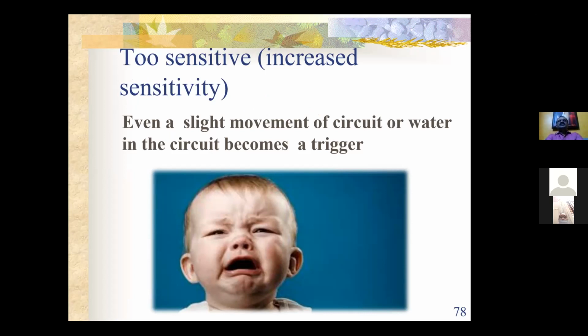So what happens is if there is a slight change in pressure or flow due to even the secretions, the machine will sense that the patient is trying to breathe and will try to support, and there will be a lot of patient ventilator asynchrony. So you should keep the trigger or sensitivity, whatever you're going to set in the machine, to acceptable limits. Usually what we set is pressure trigger or flow trigger of around -2 centimeters and 2 liters flow.